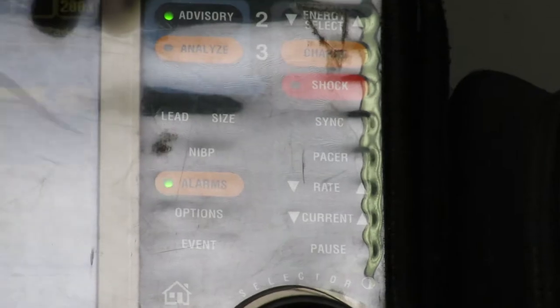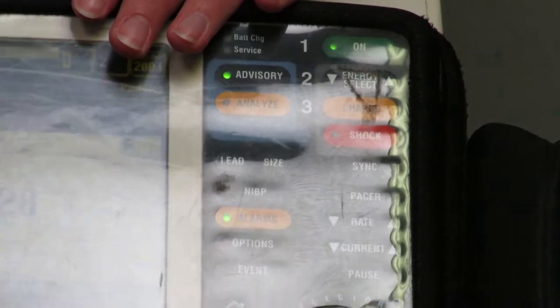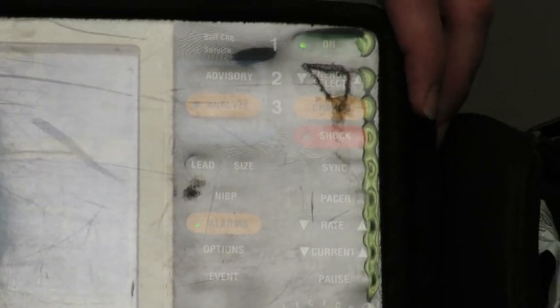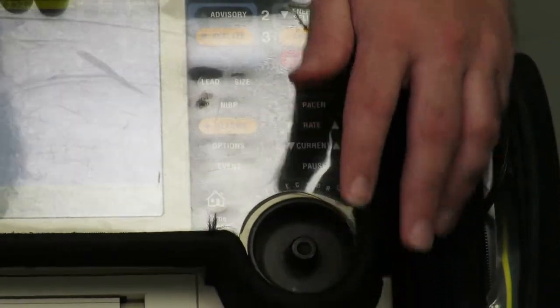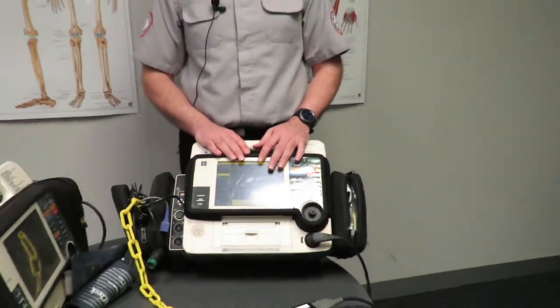Now I'll show you how to stop the machine from delivering a charge. If it's in automatic mode it won't be aware whether the patient is conscious — for conscious VT we don't deliver a shock but the machine will still charge up. Note down here it says 'push selector knob to disarm.' If the machine has charged and you don't want to deliver the shock, simply press in on the selector wheel and that stops the machine from shocking without a shock being delivered.